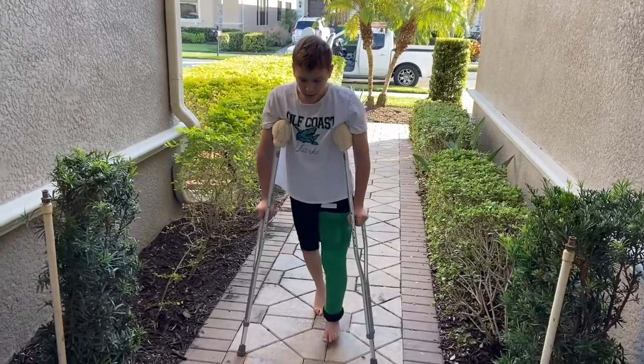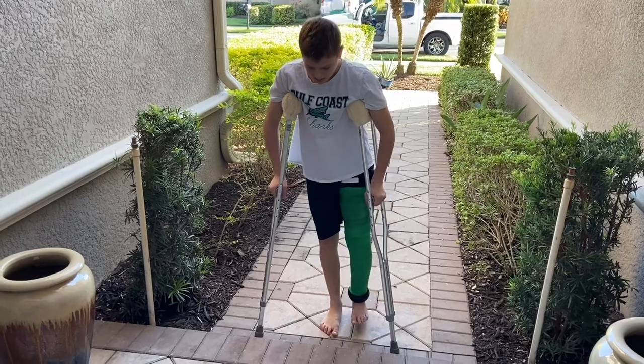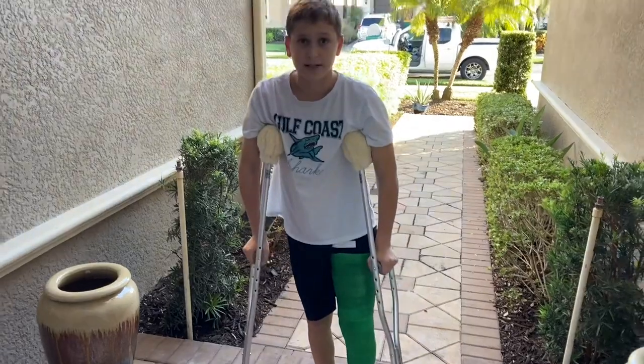Going up is a little bit more tricky. You don't want to put your foot first because then you have no support on the ground. Basically what you want to do is put the two crutches up like that and kind of push yourself up — just like that, very simple.